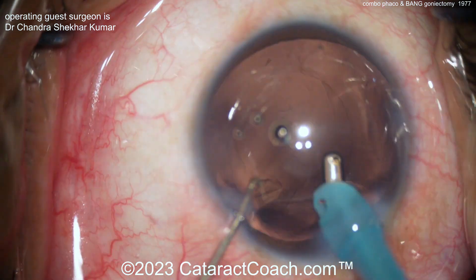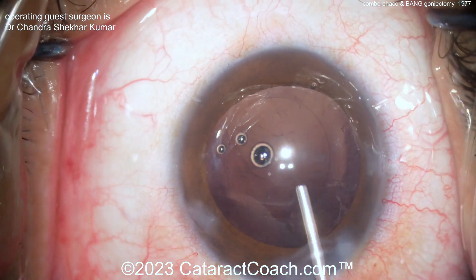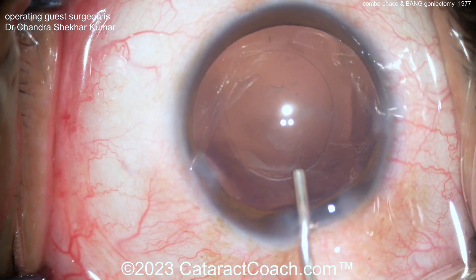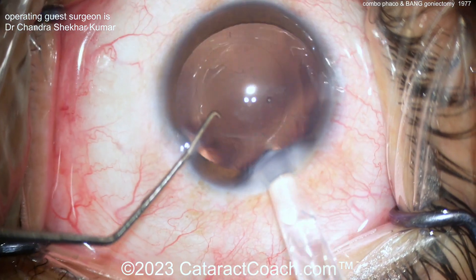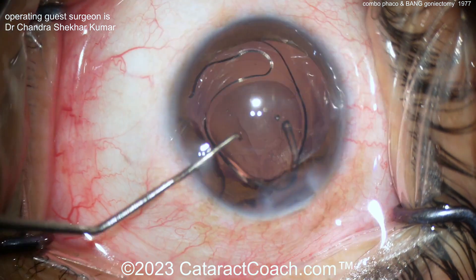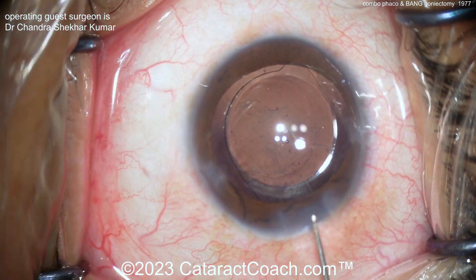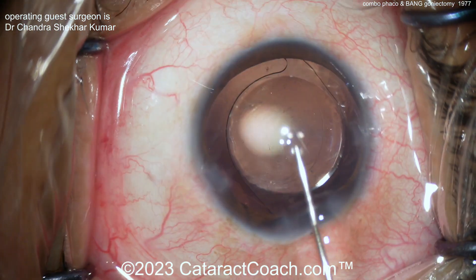Finishing up the case now — taking out the cortex. For lens selection, I like a monofocal lens in patients with glaucoma; to me that makes the most sense. You can still treat any astigmatism the patient has — a toric monofocal or a relaxing incision. All good.